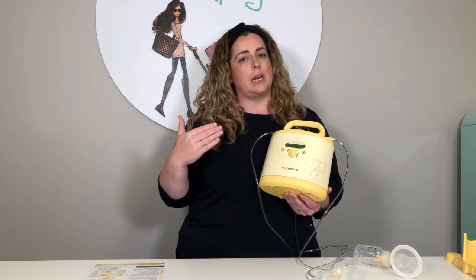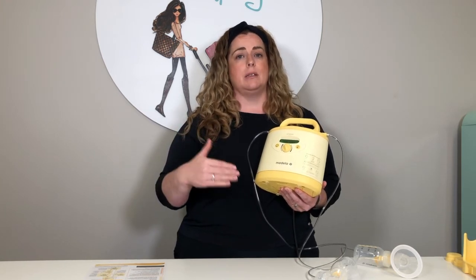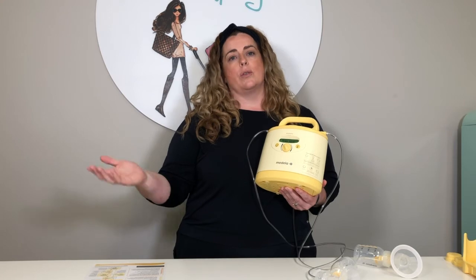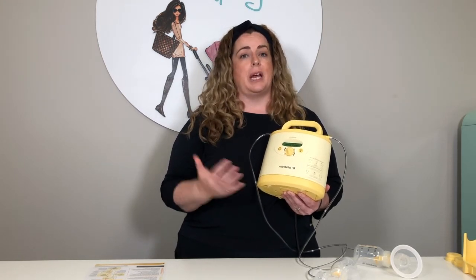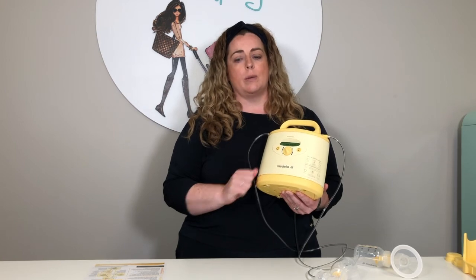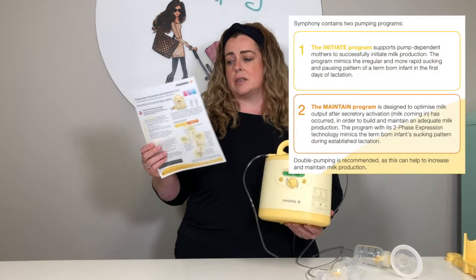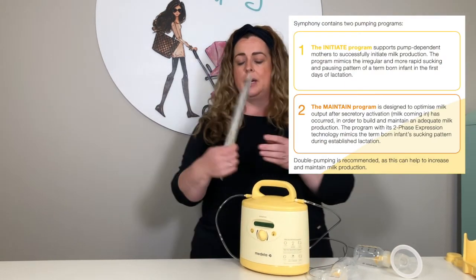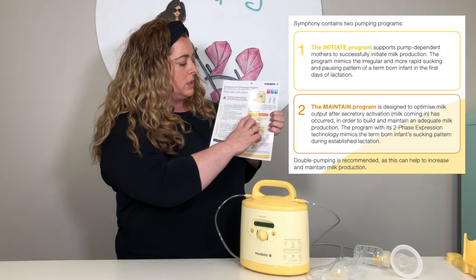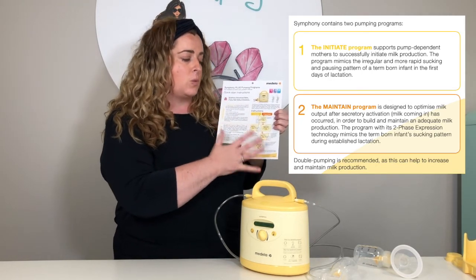As I mentioned a little earlier in the video, if you're successfully pumping 20 mils, then you can move over to the maintain program, because that is considered where you have initiated your supply. So that's the difference between the two programs. Again, I would suggest that you refer to the quick start guidelines, because there is a really helpful little diagram that is here, which helps you to decide whether you initiate or maintain. So that's a very good way of understanding it as well.